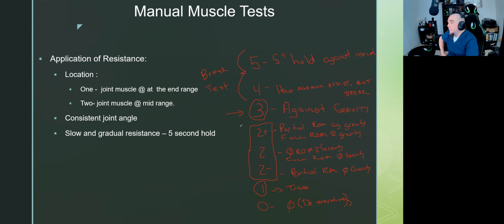So going through this again, you'd say you're testing my shoulder flexion. We always start at a 3 area. You're exactly correct. Always at a 3. So let's say Ariana's treating me and she's checking my shoulder flexion. Unfortunately, she was the last one to post, so she becomes my victim here a little bit. Well, just my tester. Last time I was in, I was a 2-. She's always going to start me against gravity. So she's going to say, okay, Mr. McKeever, this is what it's going to look like when you move through shoulder flexion.